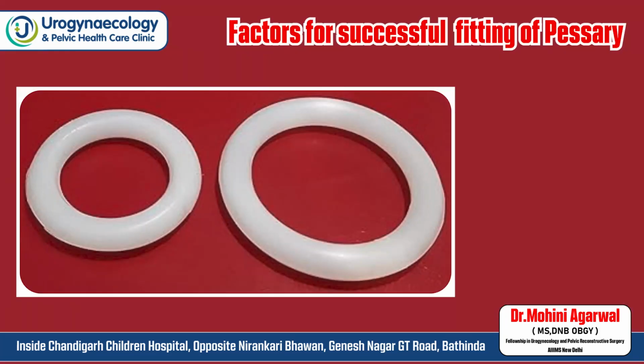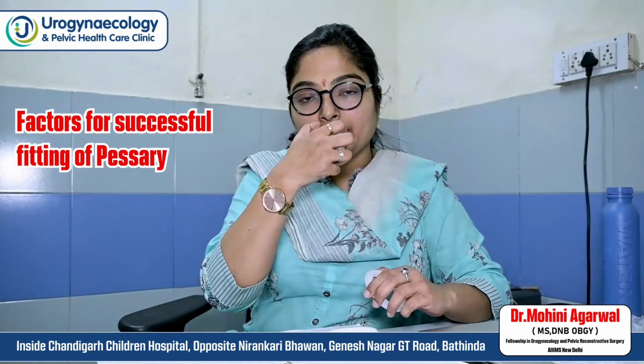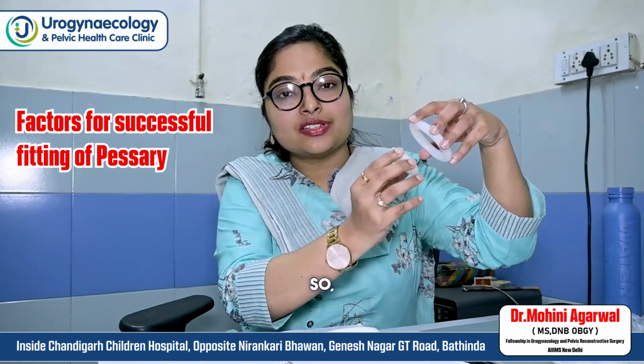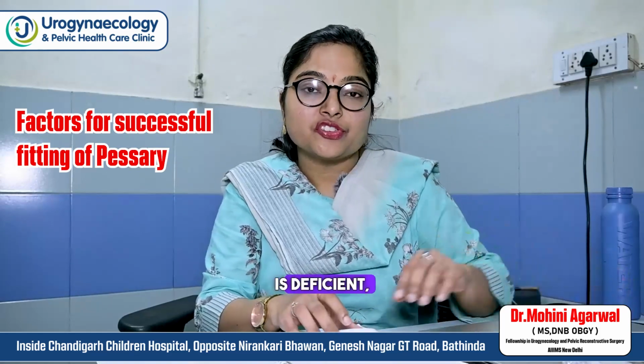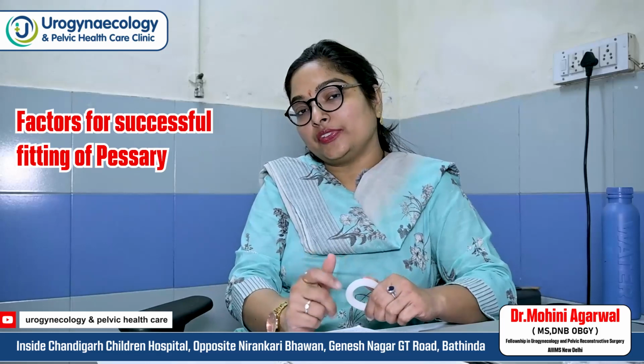So you insert 2 pessaries, one larger size up in the posterior fornix as routinely we insert, and the second pessary you insert is just 2 to 3 centimeter inside the introitus. So one is the larger size above, and second is this. So this is double ring pessary in case of deficient perineum. When the perineum is deficient, then you insert the double ring pessary. So these are for the unsuccessful fit.